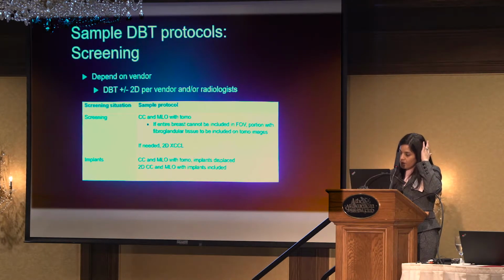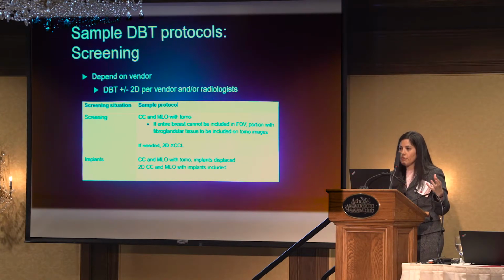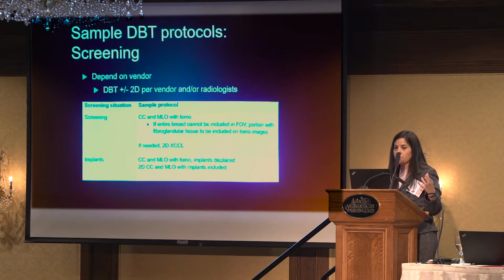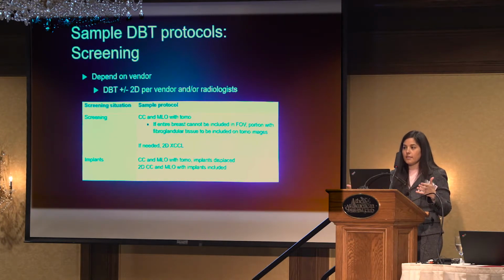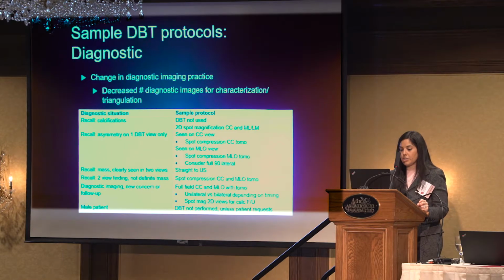We are actually still acquiring 2D in addition to the 3D data set, but as this synthetic mammography technology improves, we may revisit that in the future. We've talked to several other groups as well, and there are some places in Wisconsin and elsewhere in the country that have given up the 2D mammogram, but we still feel like there are benefits to having that 2D picture.